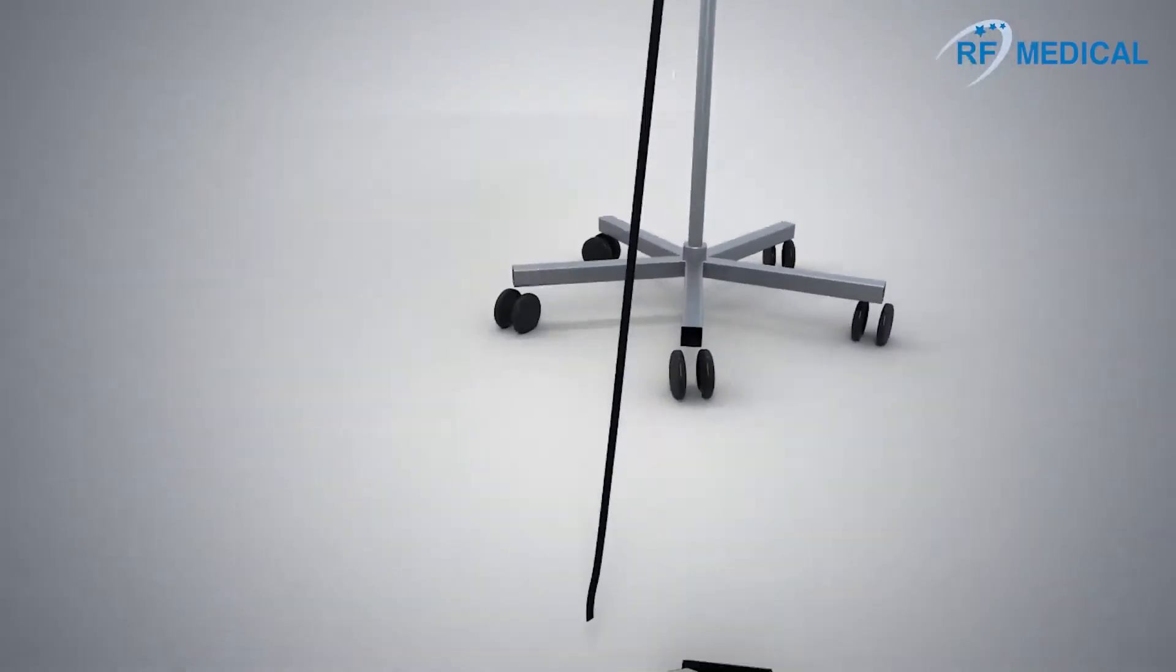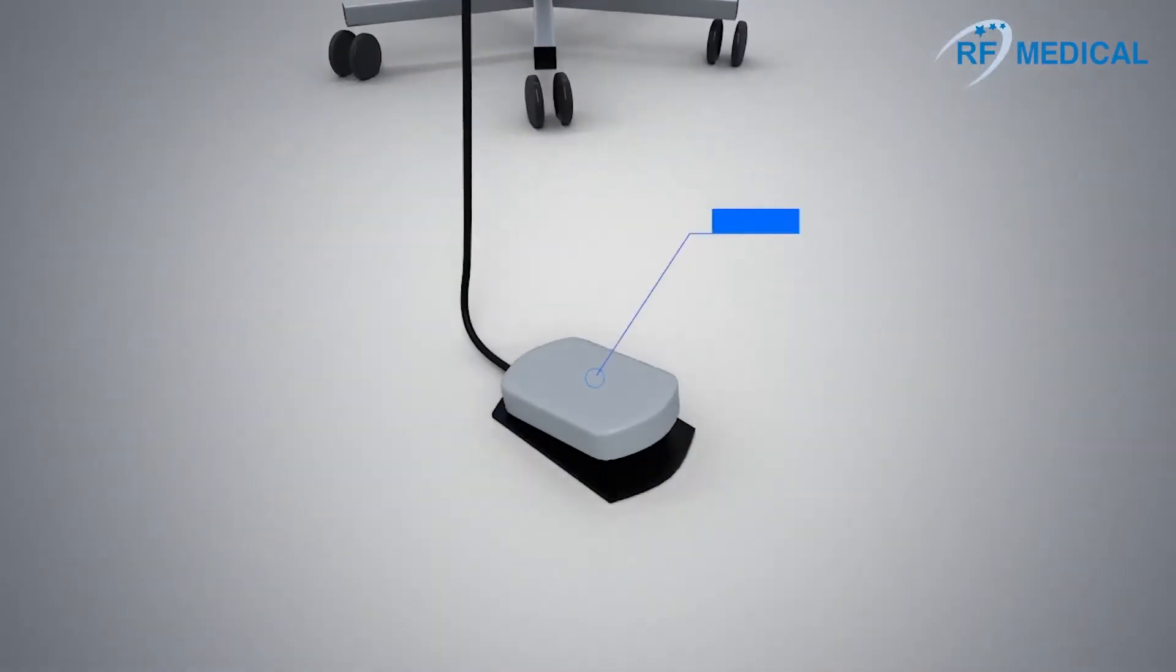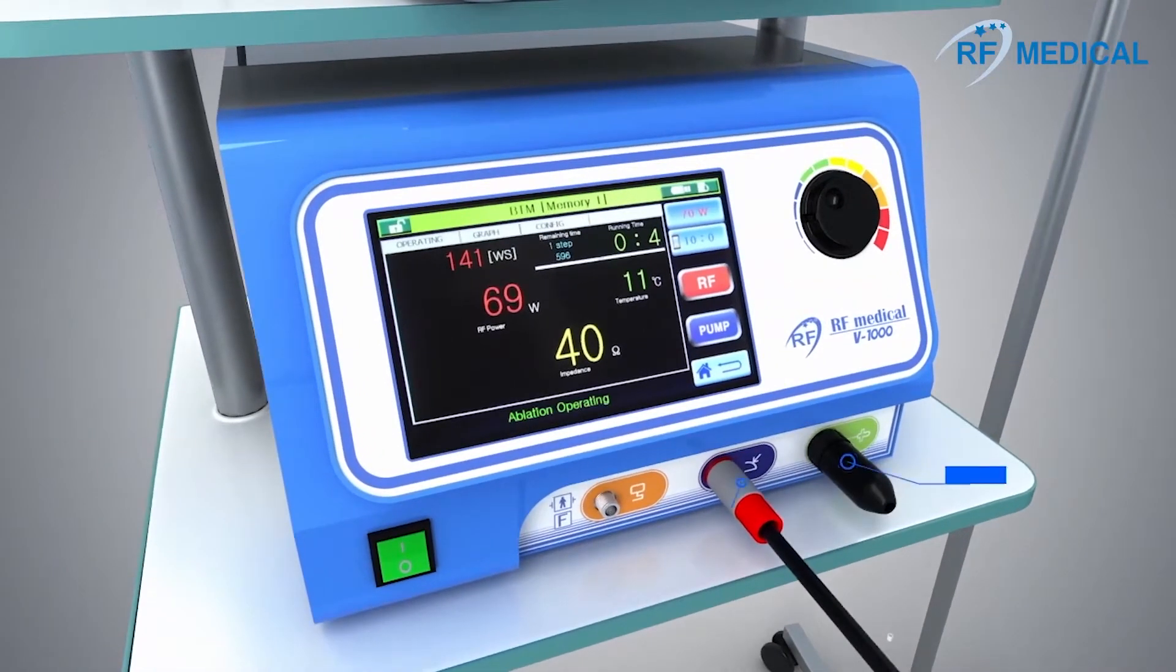The radiofrequency ablation system consists of a generator, foot switch, grounding pads, electrode, and a peristaltic pump.